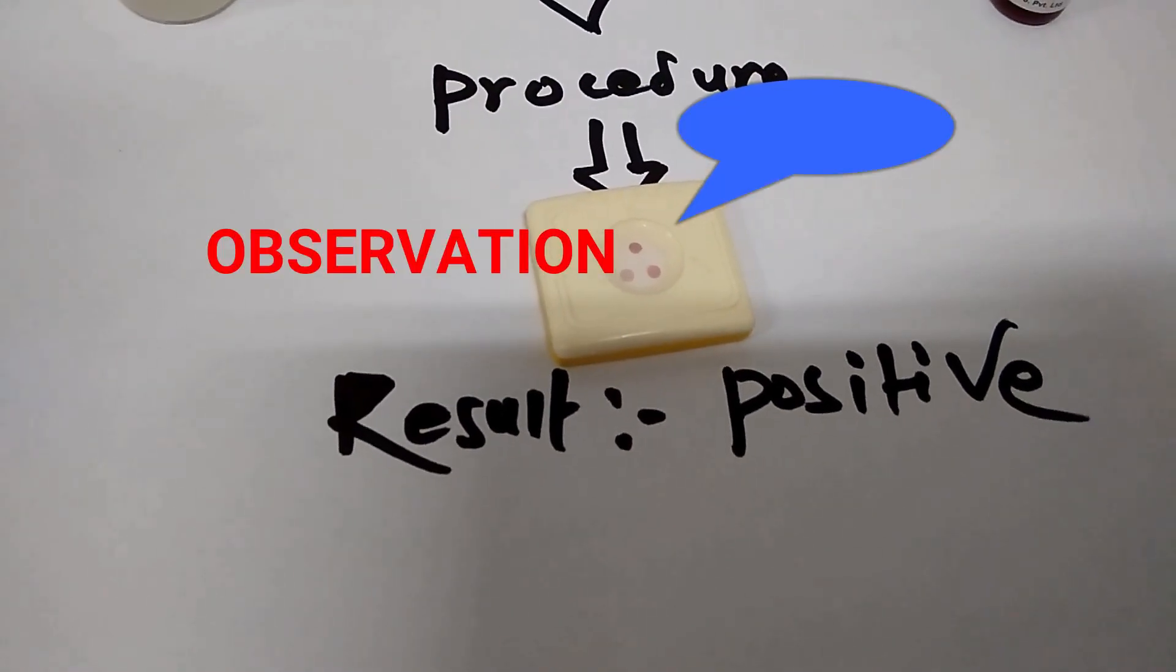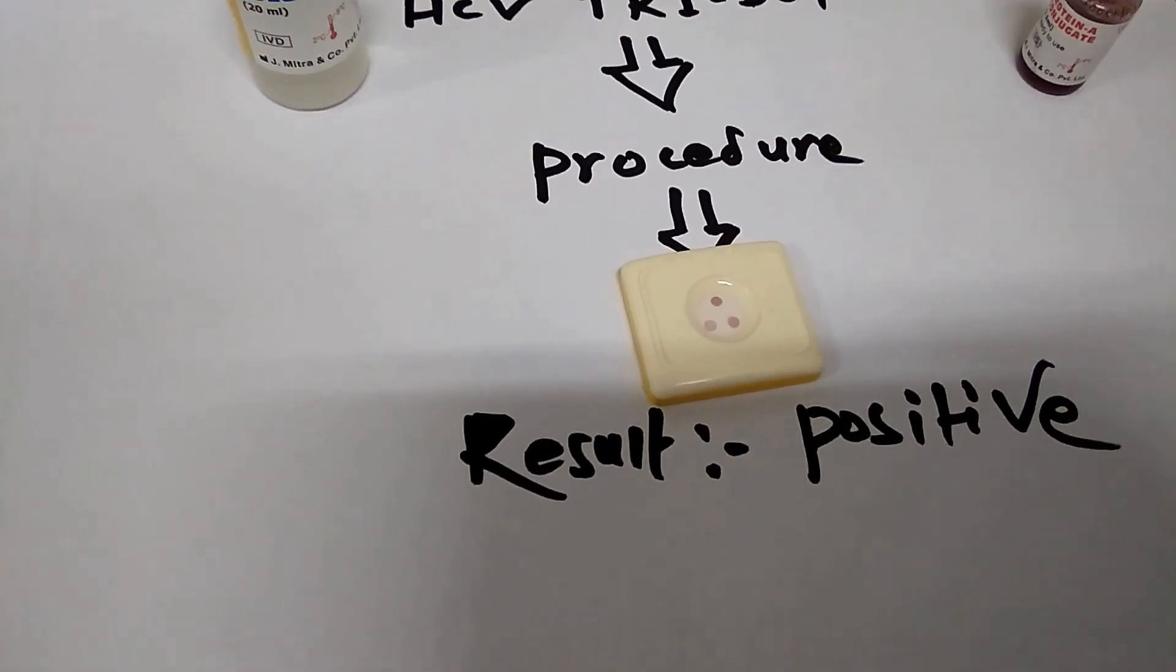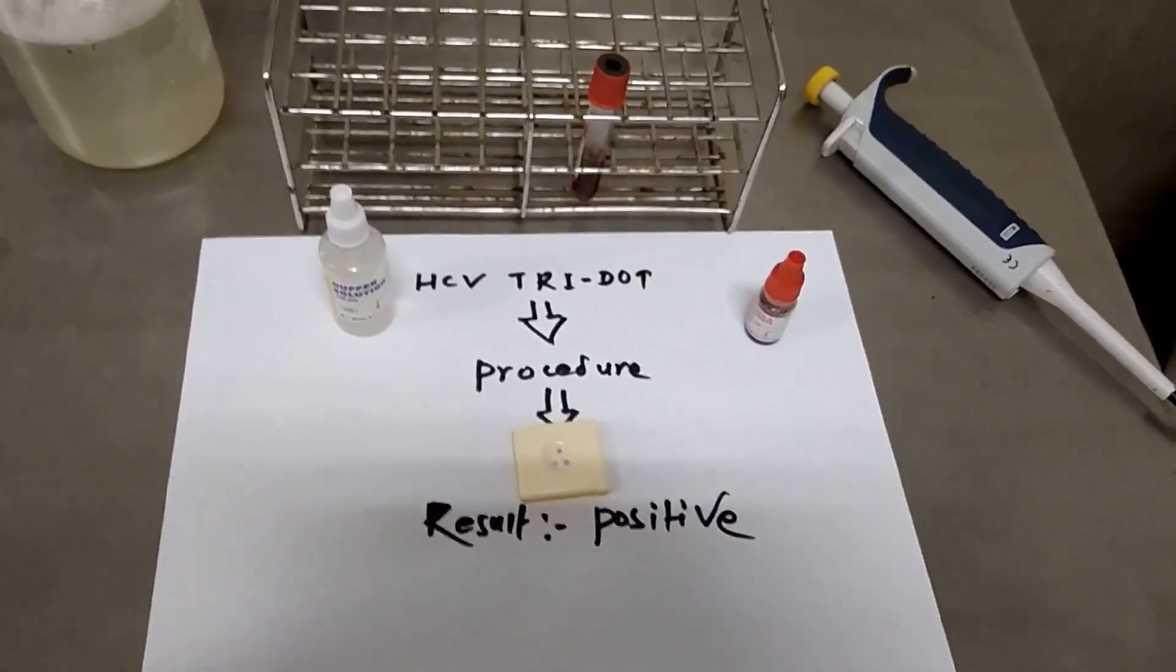No pink color dot or any pink color dot without control dot test isn't valid. So repeat with new test device.